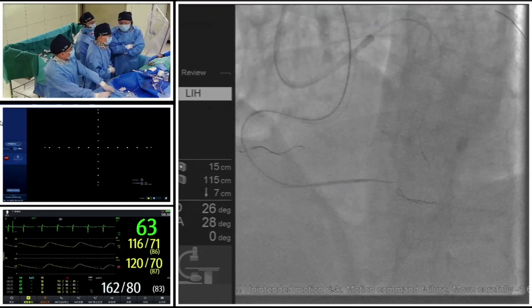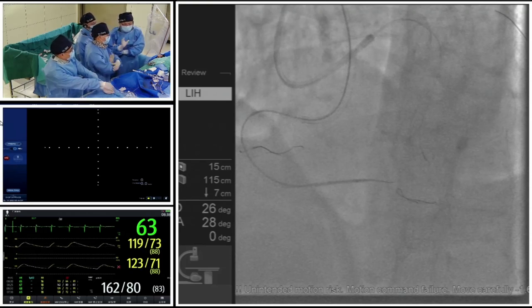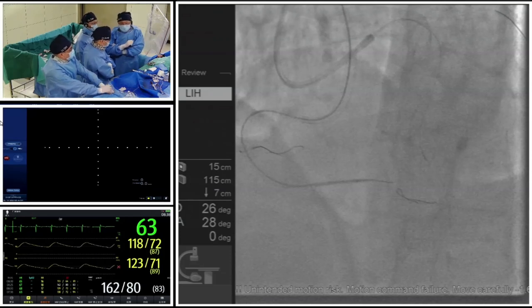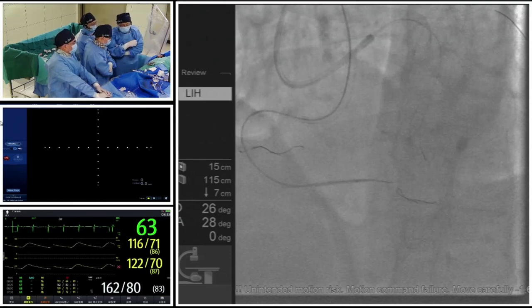We couldn't get a very good prognosis. In such a condition, we use at least a 2.0 balloon to dilate the whole length. And after maybe 1 to 3 months, we do angio again, and for some cases, we recanalize.